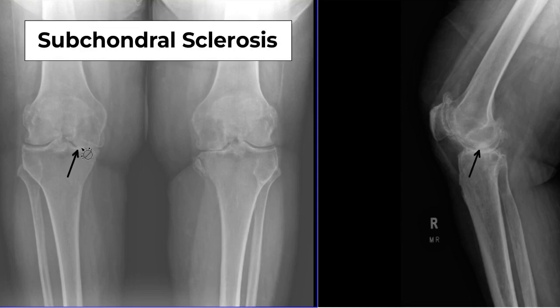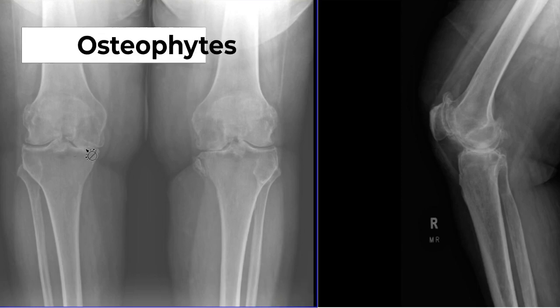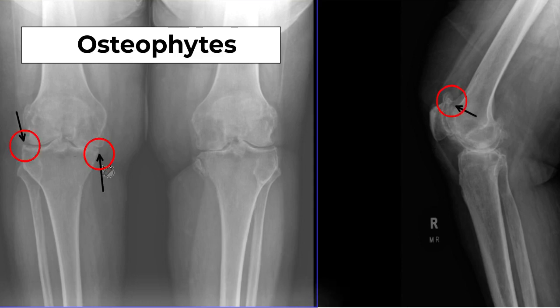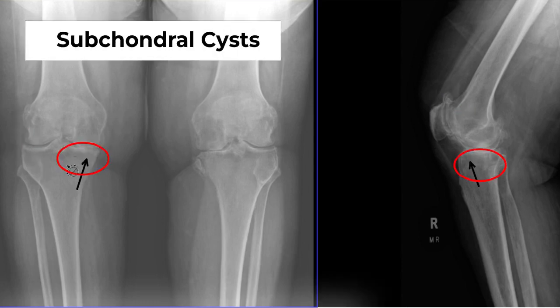The next thing we look for is subchondral sclerosis, which you can see here. This is the dense white bone that forms when you unfortunately develop bone-on-bone arthritis. The next thing we look for are osteophytes, also known as bone spurs. You can see these on the x-ray and they look like small spikes of bone on the inner and outer surface of the knee joint.